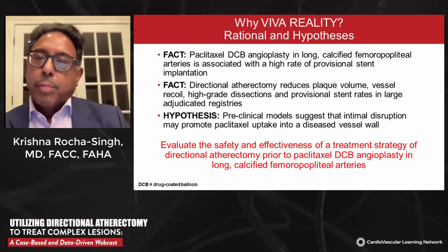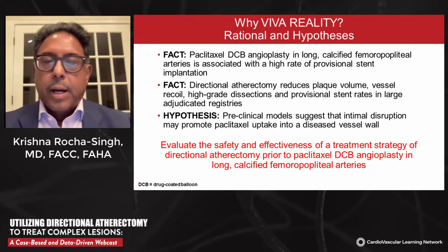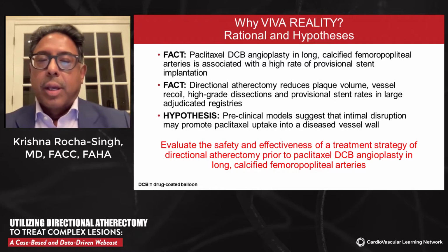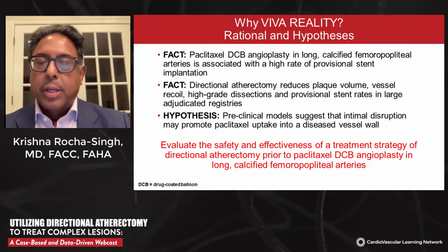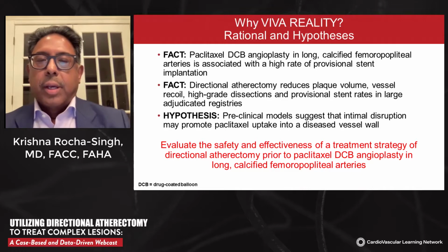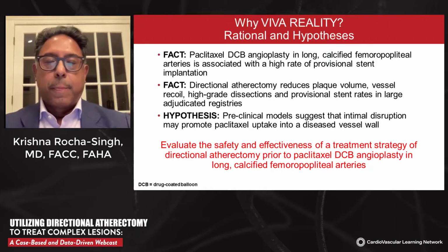Importantly, there's preclinical data that suggests that the intimal disruption by atherectomy devices may promote the uptake of the lipophilic drug paclitaxel, allowing its uptake into the vessel wall media and potentially attaching to the putative smooth muscle cell and potentially reducing intimal hyperplasia.